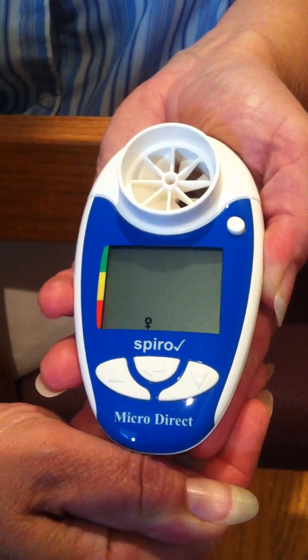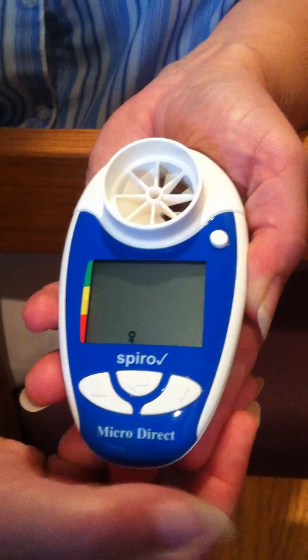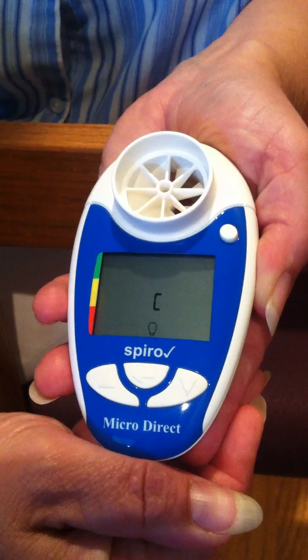Then you select the person's gender by pressing the up or down arrow key — female or male — and pressing the enter key once the correct gender is displayed.